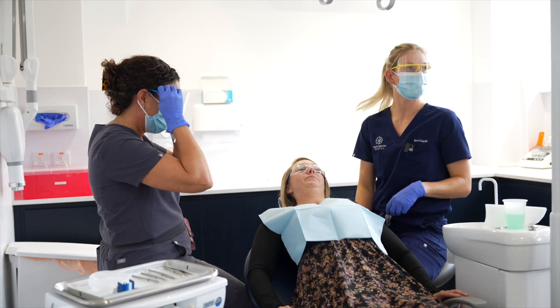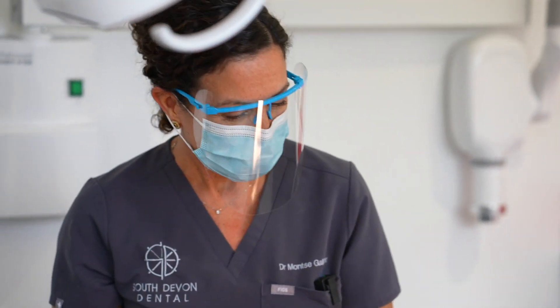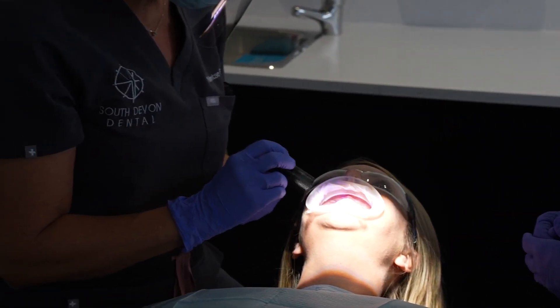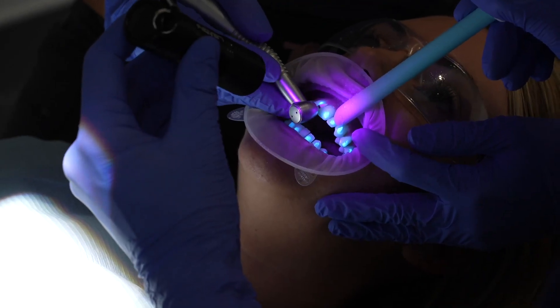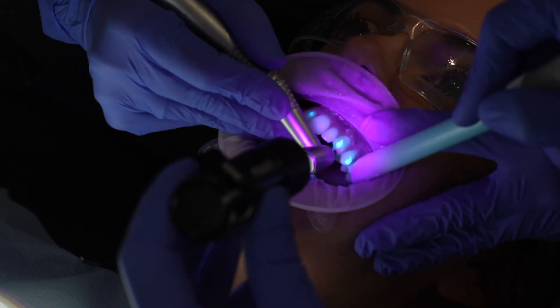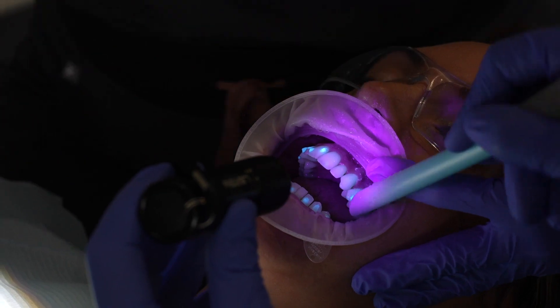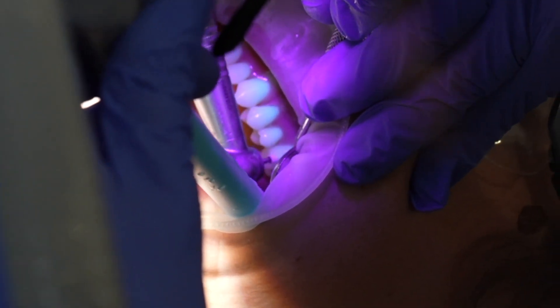We'll remove all of the attachments that you are wearing now. When we have to remove attachments, it's so easy with Aligner FlowLC — when we add the UV light we can see the attachment with the fluorescence, making it much easier, and we don't remove any enamel.